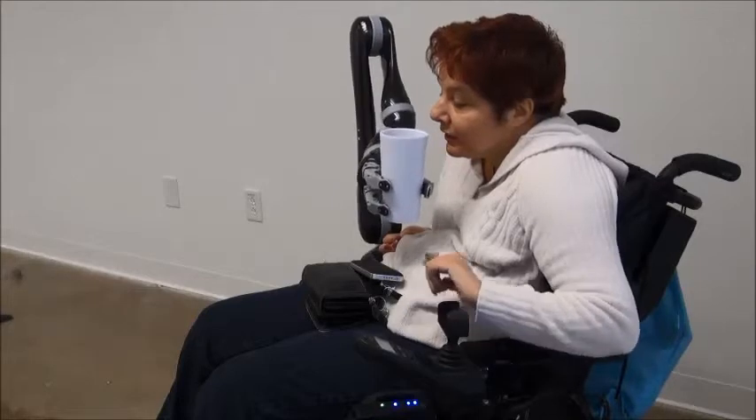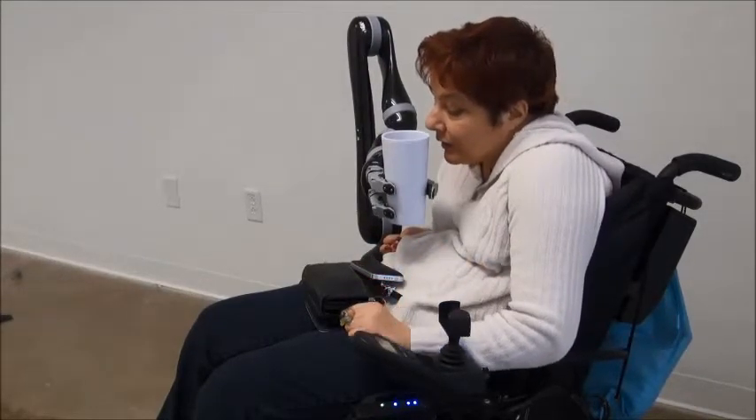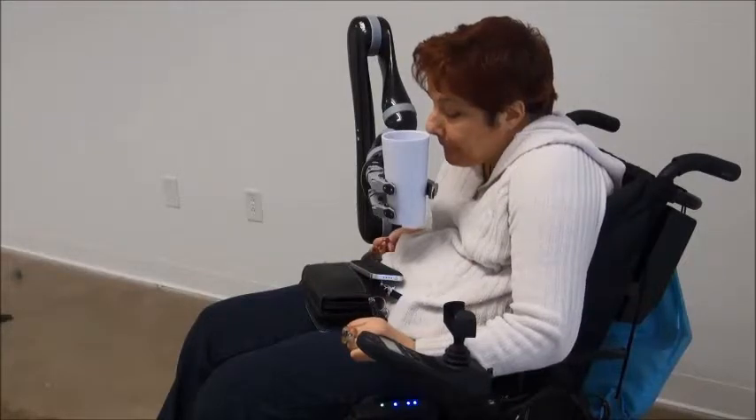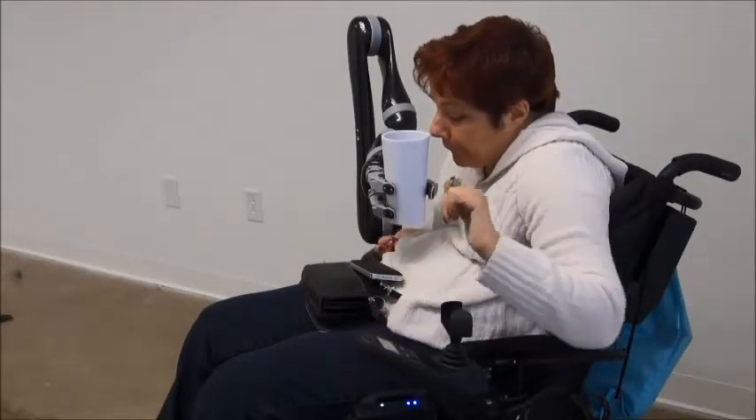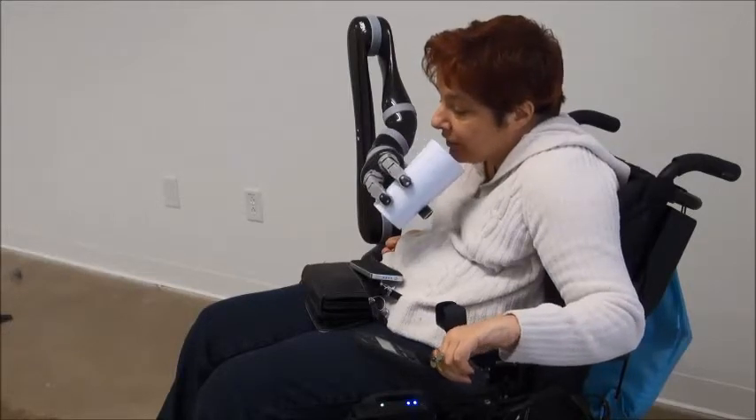It is easy to get the liquid in my mouth. But without, I could never drink.